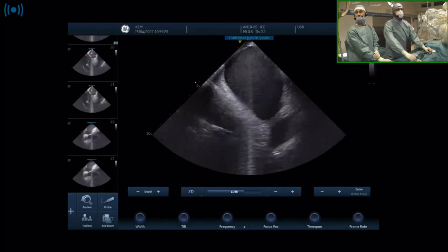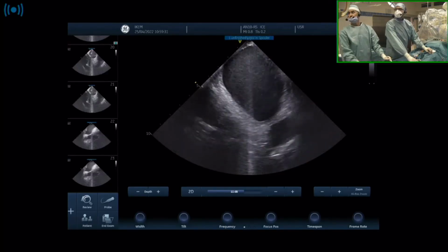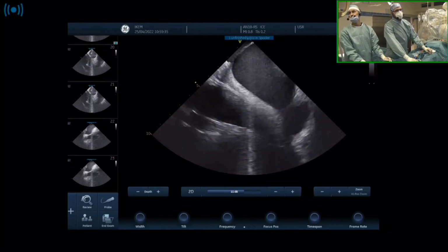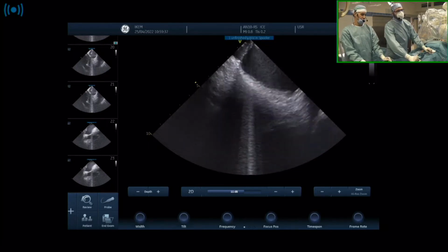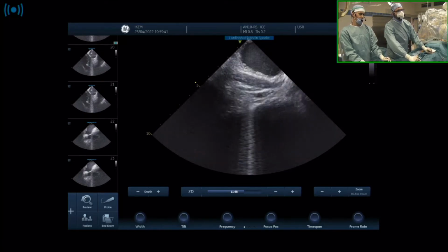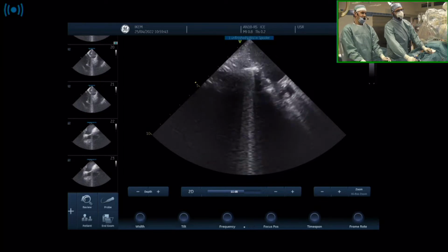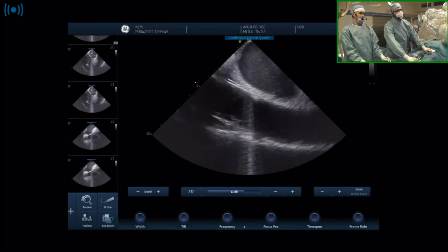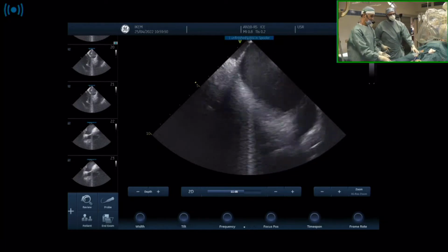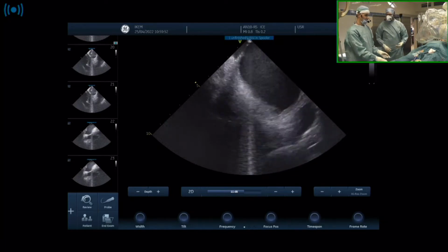Okay, so we see here a pretty small atrium with a left common trunk, and the right-sided veins are pretty big. We measured the right superior at 2.0, 2 centimeters. Okay, and then we will show you the map we did. Yeah, if you want to take over from now. Thank you, Predrag.